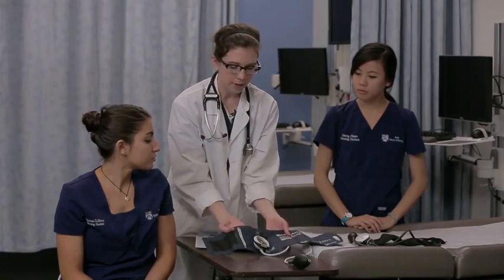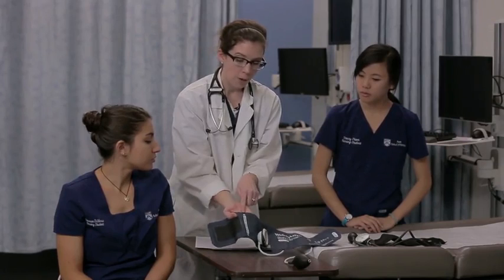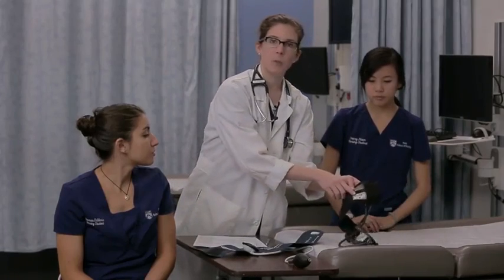Now, it's very important to make sure you have the right size cuff when you're taking a blood pressure. There's a marker, an indicator, on the blood pressure cuff that shows you where to line up the cuff with the patient's artery in their arm. Here it is on the smaller cuff.